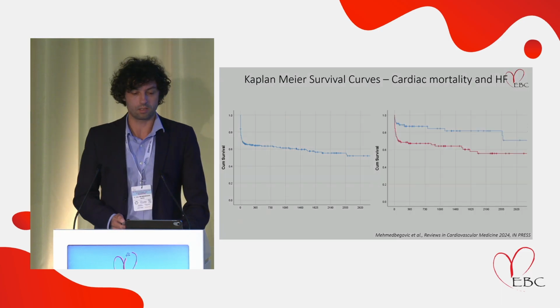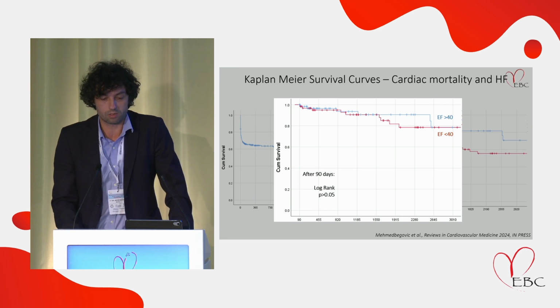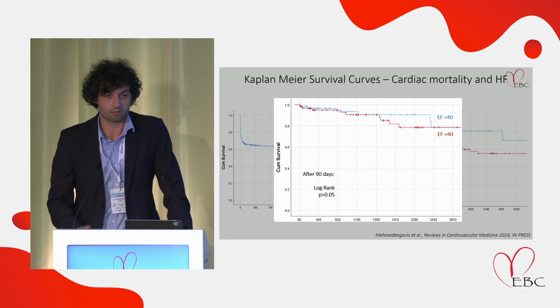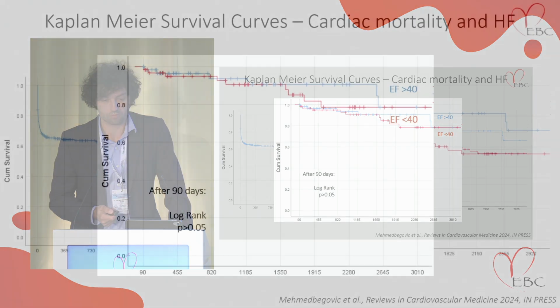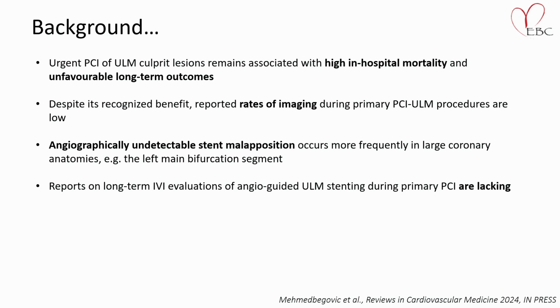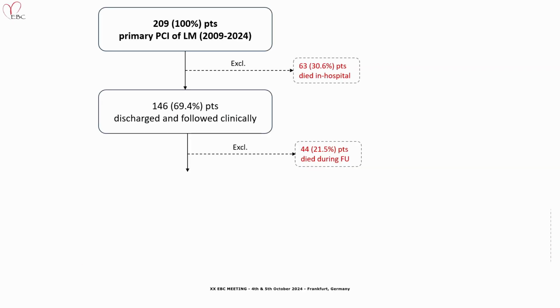But when we looked at the data after 90 days from the procedure, we can see that there is no more effect of the low ejection fraction, and the patients with preserved ejection fraction still have events. So we get to the objective of our study: to perform the long-term OCT imaging of DES implantations in patients with angio-guided unprotected left main PCI who had uneventful clinical follow-up.